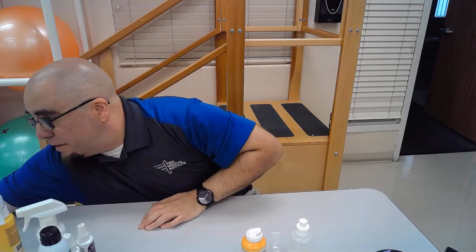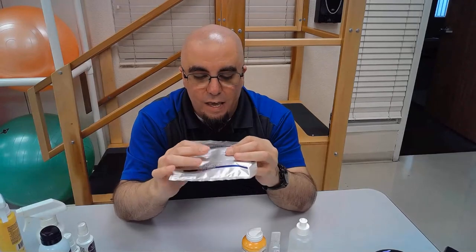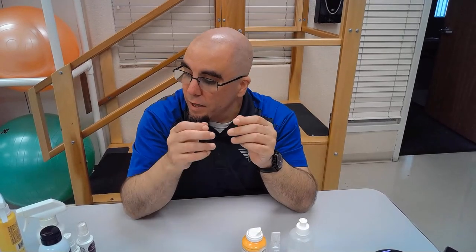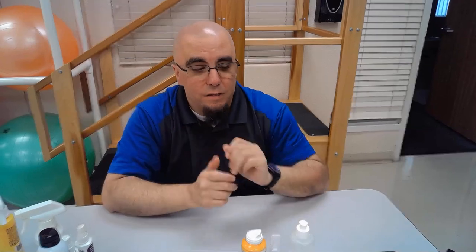One more I forgot: Tender Wet — this is a hydrogel-impregnated gauze, used for wounds that are too dry. That covers all the dressings. Next I'm going to get set up, and we'll look at a patient that already has a dressed wound — we'll set up to take care of that wound and then address it.